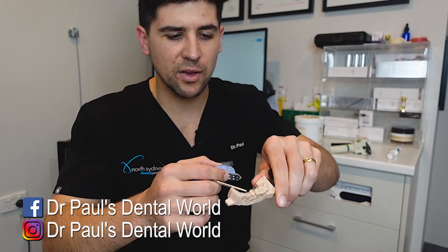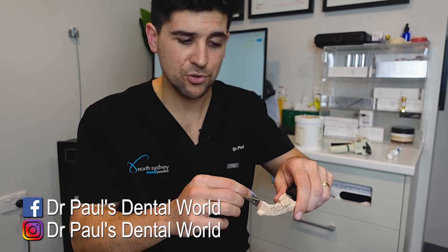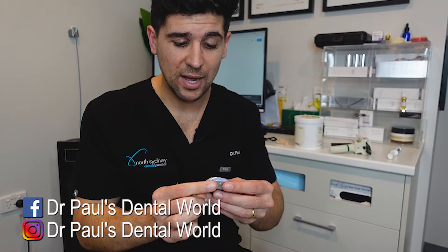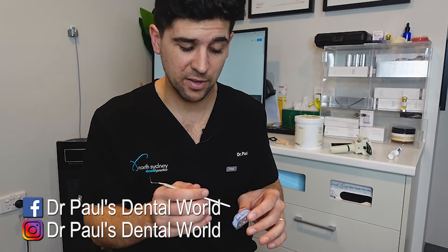You'll see that the excess is still here on the buckle and the palatal. In the mouth, that won't happen — the excess will actually come away with the tray. I think it's just sticking to the acrylic here. You'll see how it works in the mouth. But the main thing is that this is still in place. Now, don't rush to get this out — make sure that you wait long enough till it's actually finished.